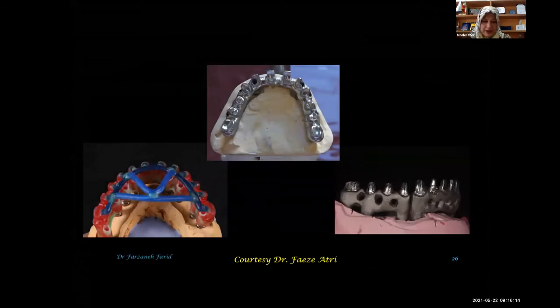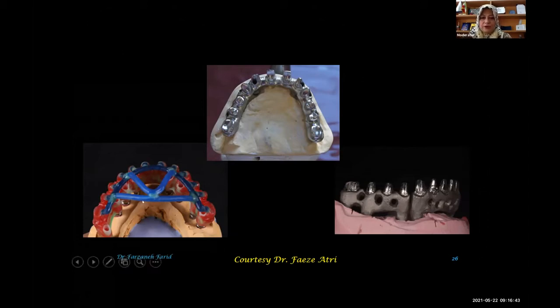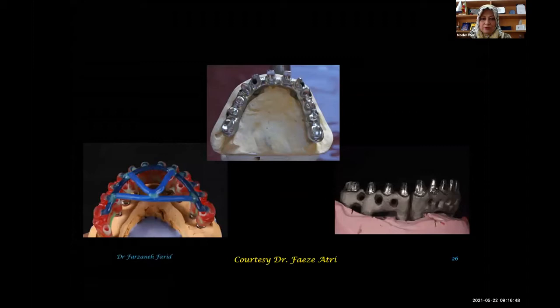Here, as you see, we are comparing the conventional technology with the CAD/CAM technology. In the upper picture, you see the CAD/CAM technology. Everything is in one piece. Every margin is sharp, and for the lab, it was very much easier to make than to wax up, like the lower part, and to have a screw attached in the correct places.